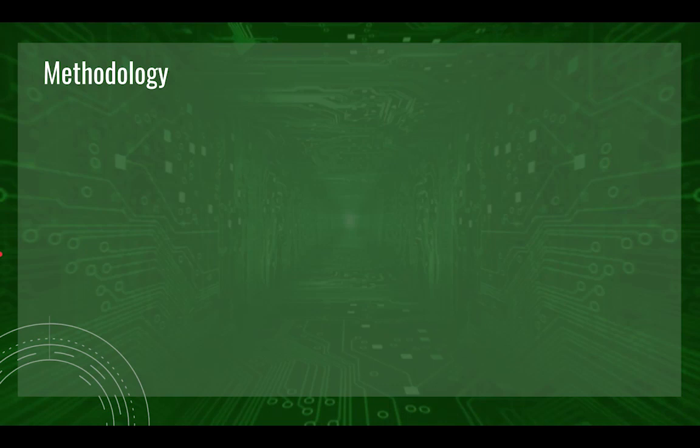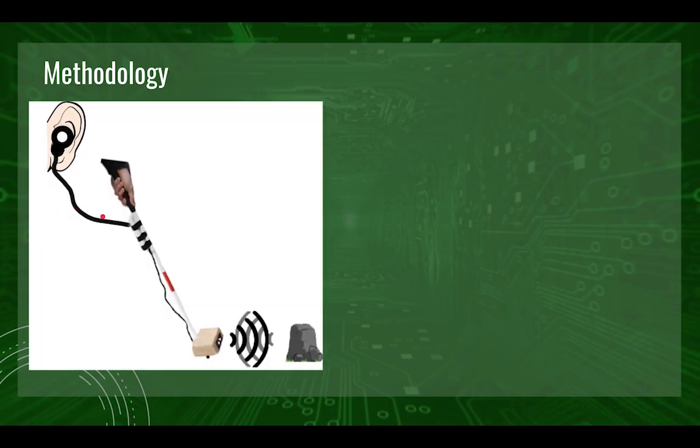In order to build our prototype, the components were attached to a regular walking stick. In our lab experiments, the raw echo amplitude with the ultrasonic sensor pointed at a person at a distance of 25 centimeters was only approximately 26 millivolts. Hence, we implemented amplification, peak filtering, and envelope generation in our design so that the Arduino could digitize the return echo properly.